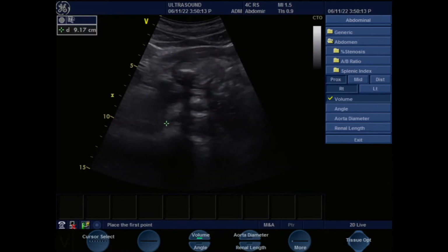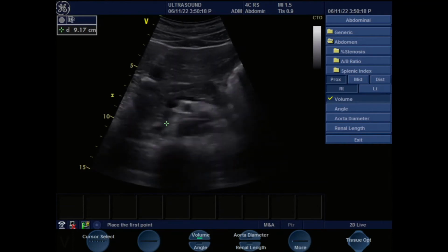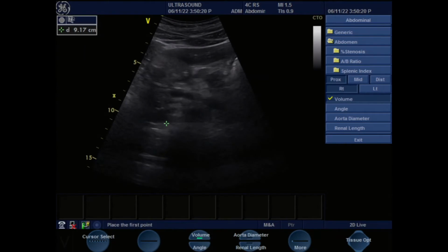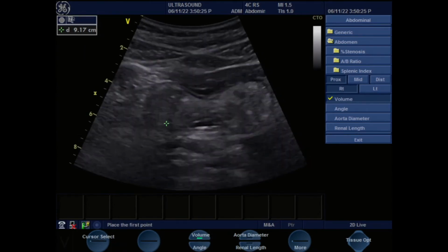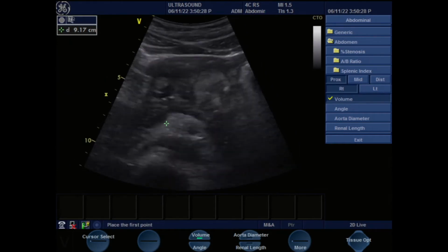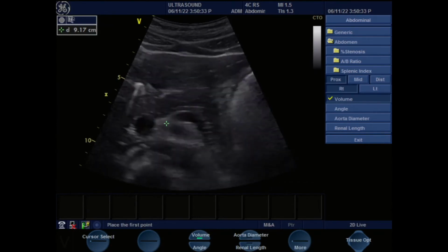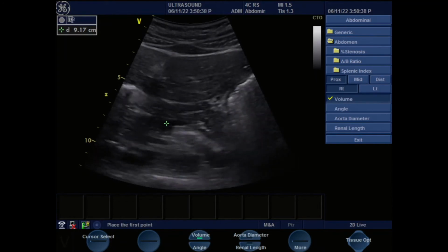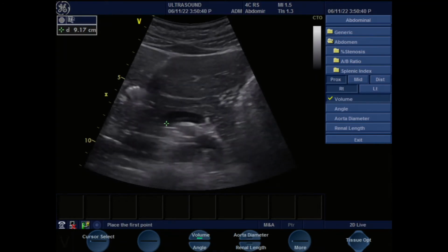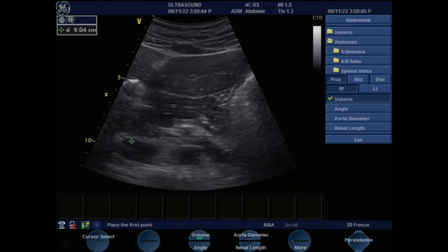Okay, so Hussain, I'll have you push your belly out, make a fat belly, blow it out. Okay, you may relax. Okay. Thank you. Let's turn the beam down a little bit. Let's have you make a fat belly again. And then you come up and in there, so that sort of pushes the pancreas out. My image on the screen looks much better than up there. Freeze, relax, breathe.